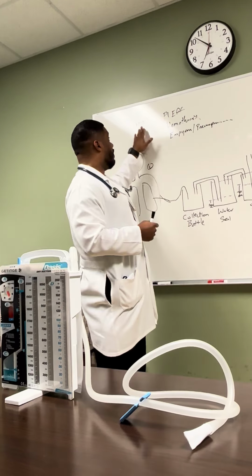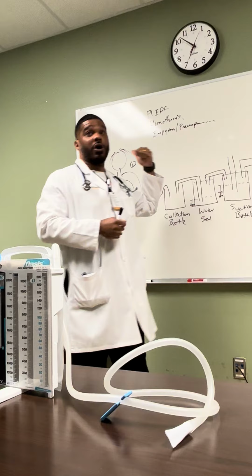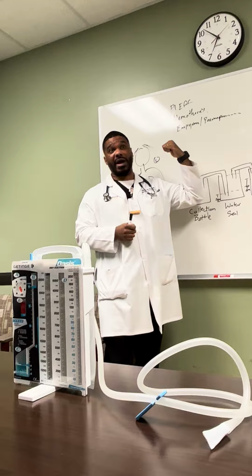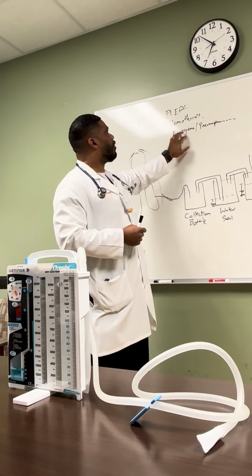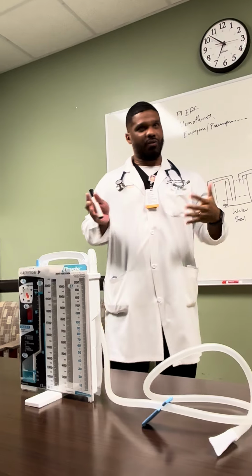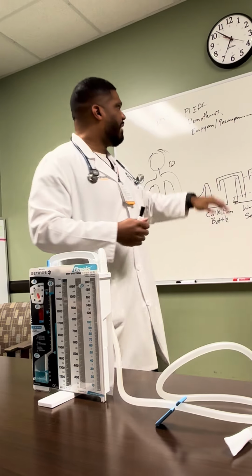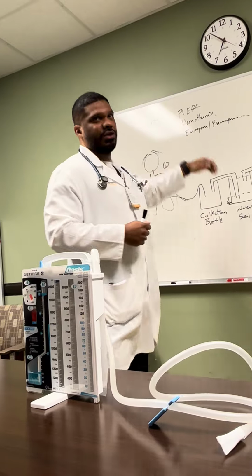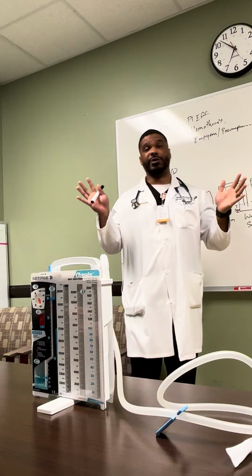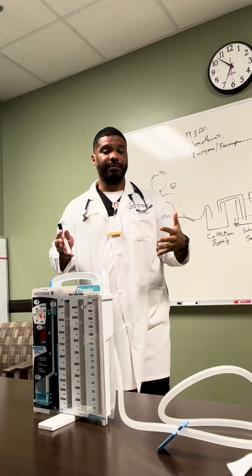All right. So for somebody with a pneumothorax, this patient should be on wall suction as much as possible, especially with a new pneumothorax. For somebody with a pleural effusion, hemothorax, or empyema, we can start to play around with that a little bit in terms of wall suction, okay? But for somebody with a pneumothorax that needs to go for transfer and all that, transport to another area of the hospital, that patient should be on wall suction as much as possible.